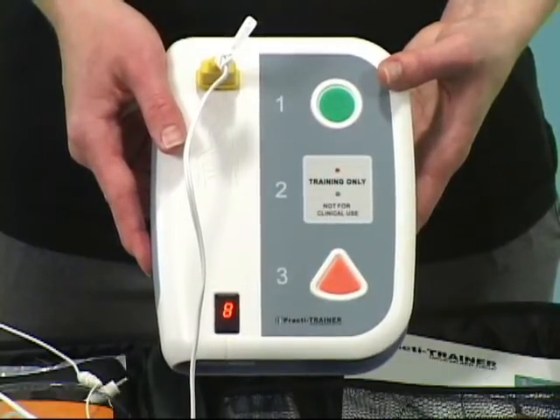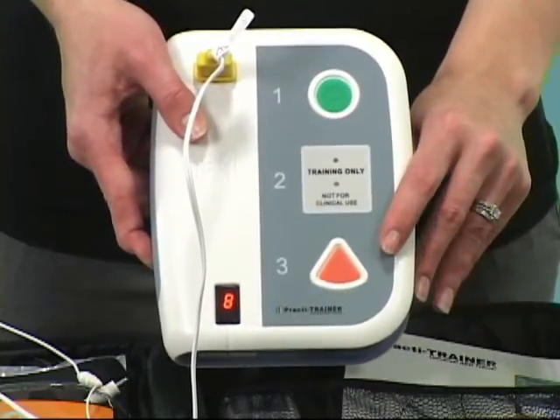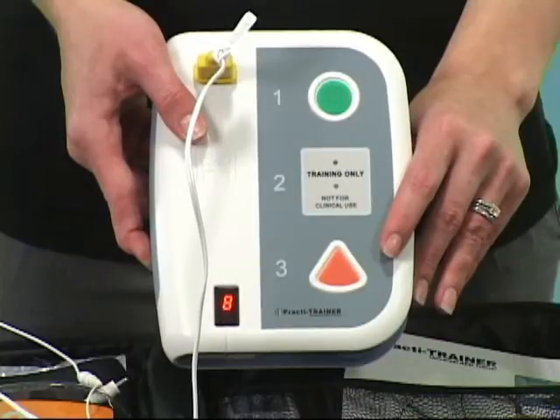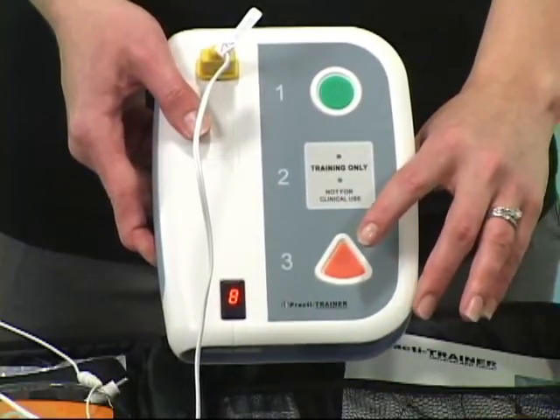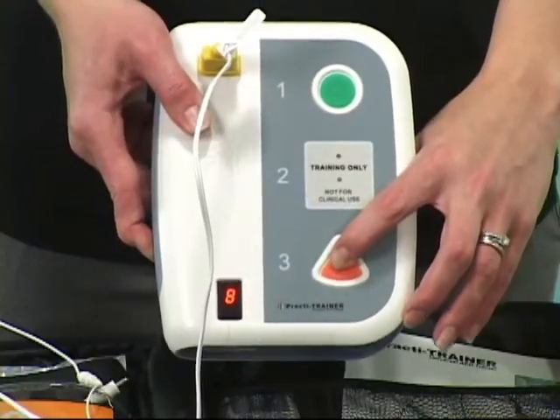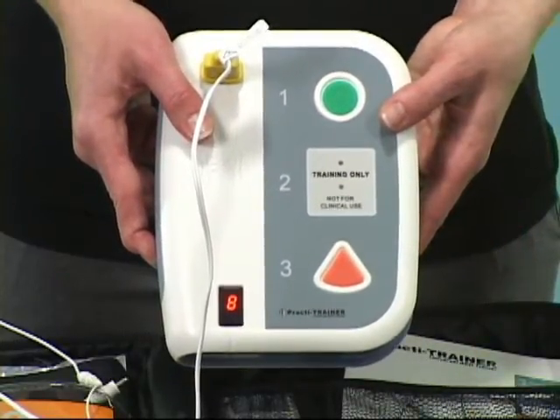Shock advised. Charging. Stay clear of patient. Deliver shock now. Press the orange button now. Shock delivered. Begin CPR.